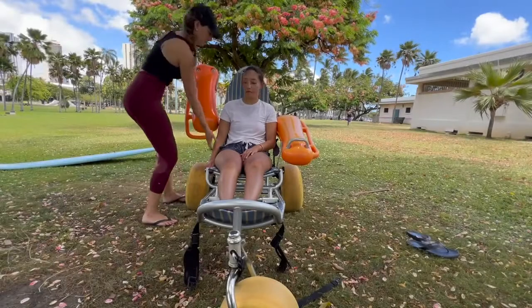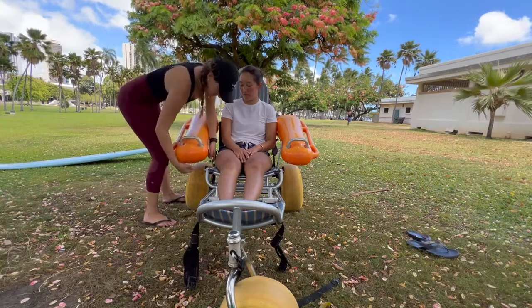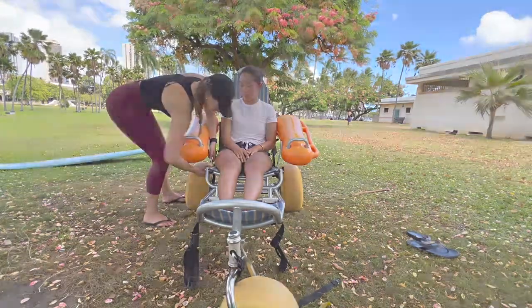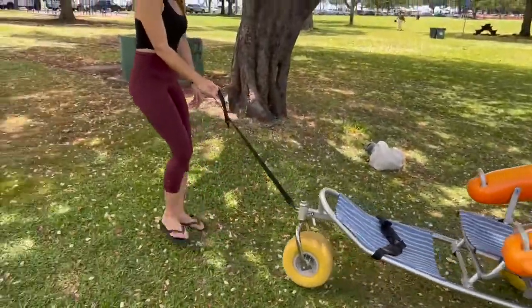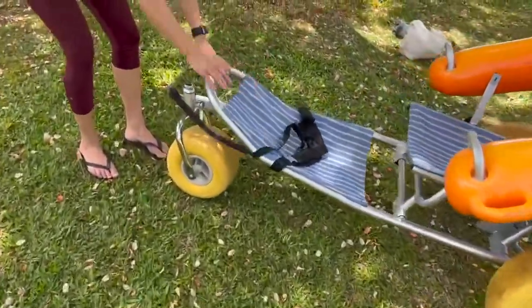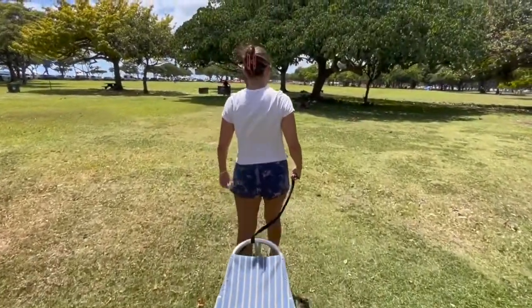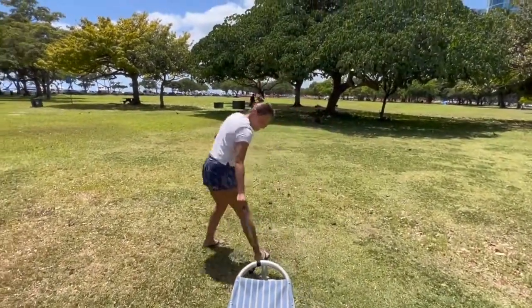It is important to be aware of the participant's position and be careful of their limbs when moving the armrest back into place. One volunteer should use the rope at the front of the chair to help with pulling and steering. The team pushing from the back of the chair should pay attention to the person steering to avoid running the wheel over their ankles.